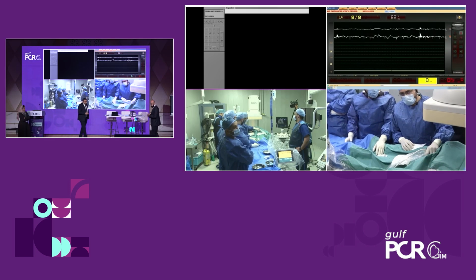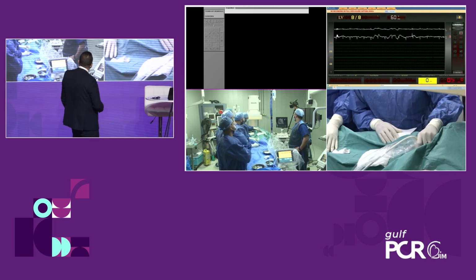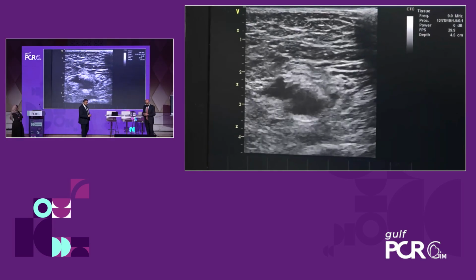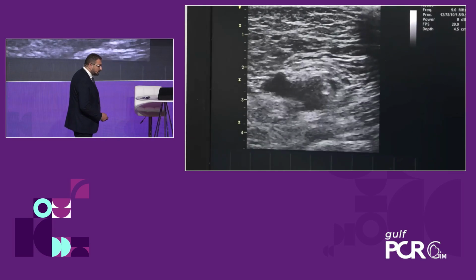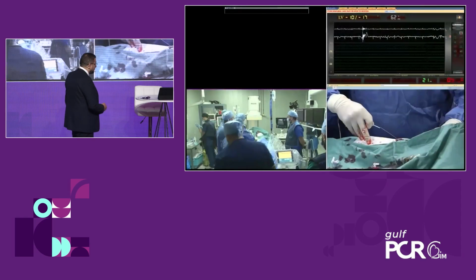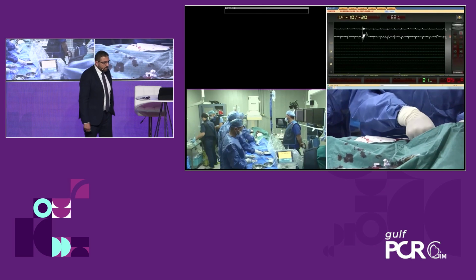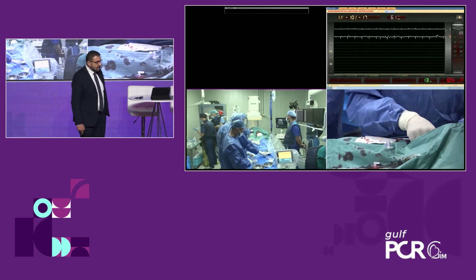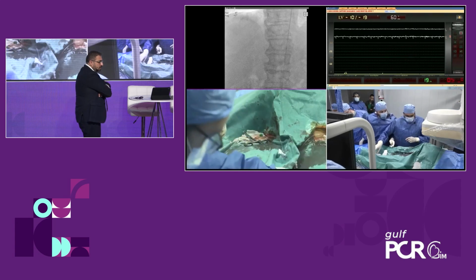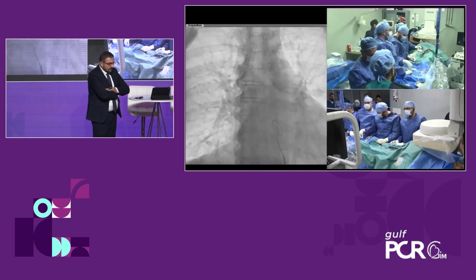Great. So this was a case, and these were my team members. And as you see, ultrasound-guided puncture allows you to have lower incidence of vascular complication, lower contrast as well. So as we mentioned, accessing the right side with the eSheath, and the left side with 6 French femoral artery and femoral vein. But we don't insert a pacemaker. We only use a Safari wire for LV pacing.